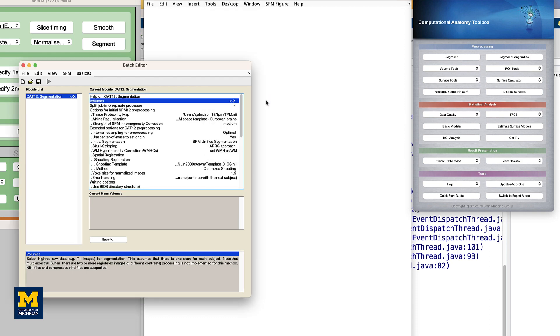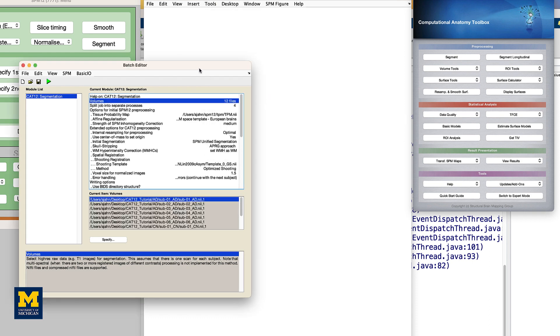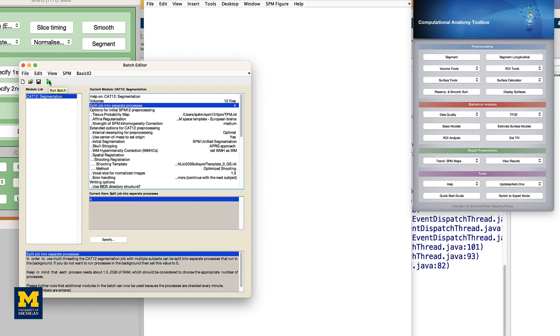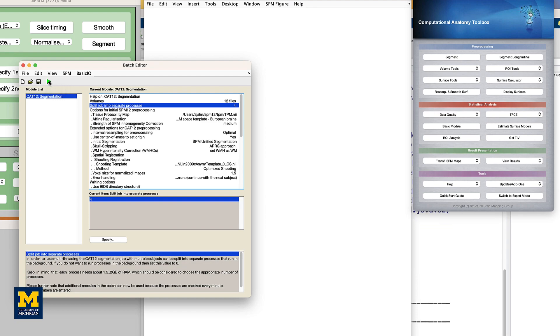We will leave the rest of the options as the defaults. You can take a quick look through them to see what they do, but for our purposes, we're going to leave them as they are. For now, take a look at the field Split Job into Separate Processes. The default value is 4, which means that 4 processors, if available, will be used to analyze the data. Now click the green Go button and observe what happens.